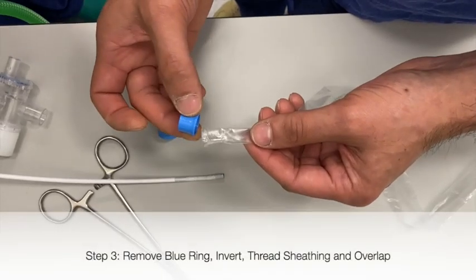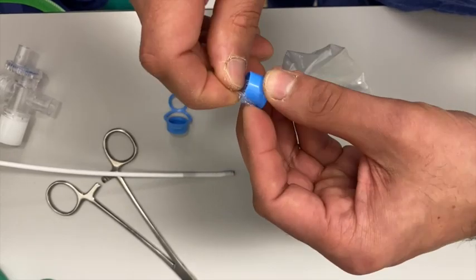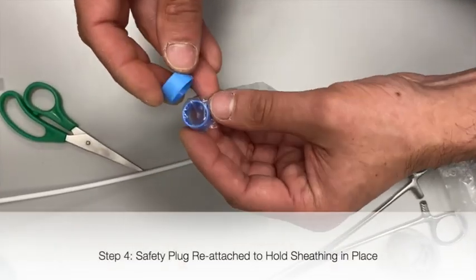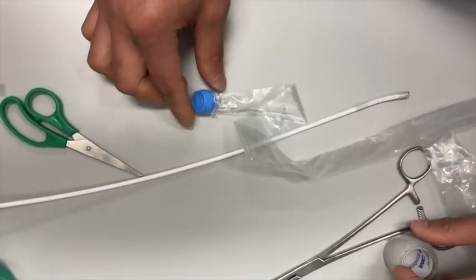The blue plastic attachment is removed, inverted, and the sheathing passed through, pulled over and inverted over the edges. The blue plug can then be used to hold this sheathing in place, and tape is then used to create an airtight seal.